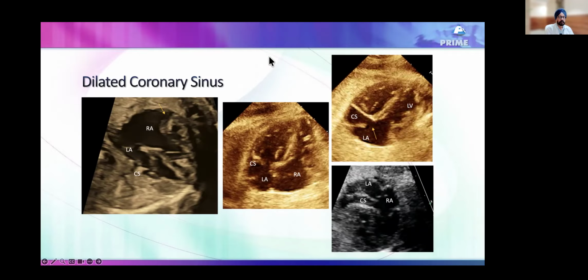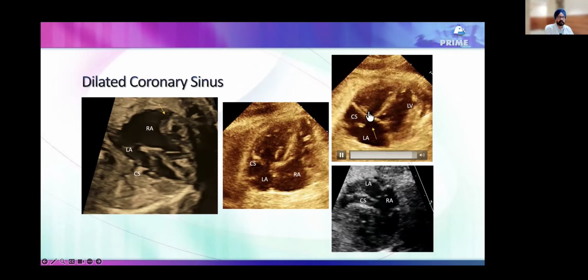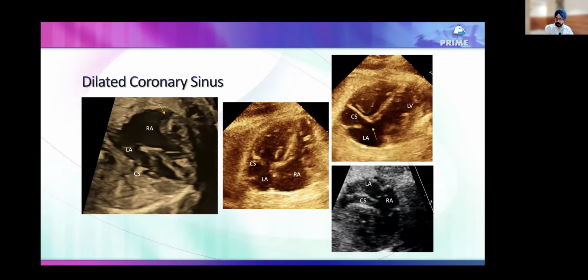Yes, when the mitral valve is closed. When you see the mitral valve is not opening well and you see the tricuspid opening well, that means you are not in the plane of the mitral valve. You are posterior to that.